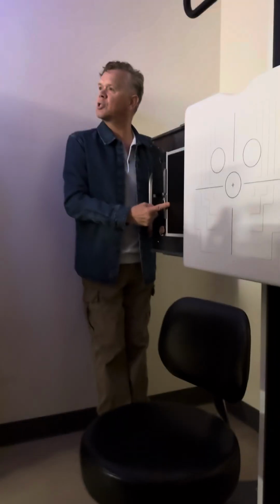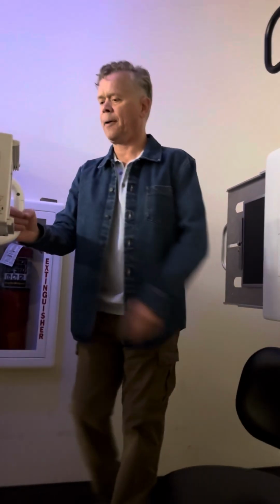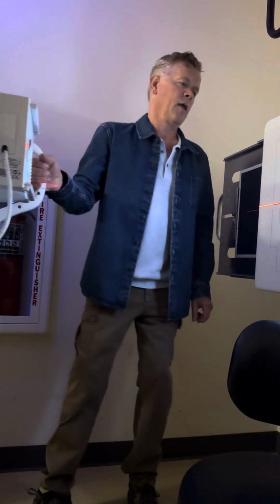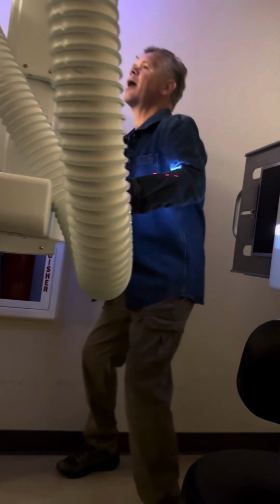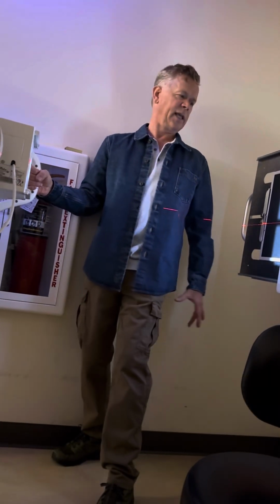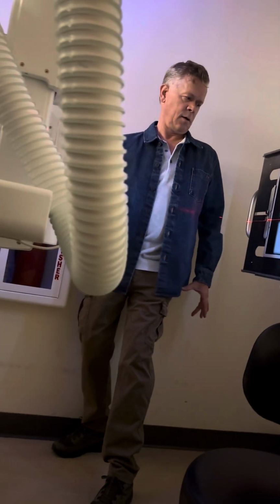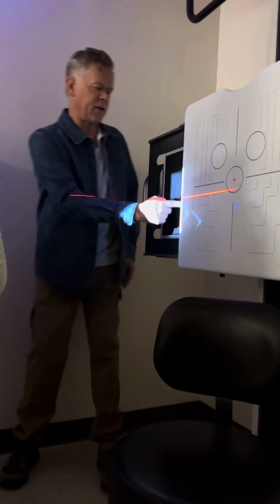So here's the image receptor. If I take it out, it's no longer within the Bucky device. Face is no longer more than 9 centimeters. I don't need a Bucky device for it. The problem is trying to get it to come over far enough laterally. Whoops, watch it run away from me now. This thing hates me. Come here, stay. So that the nose can be here.